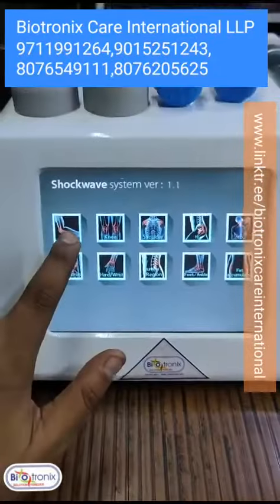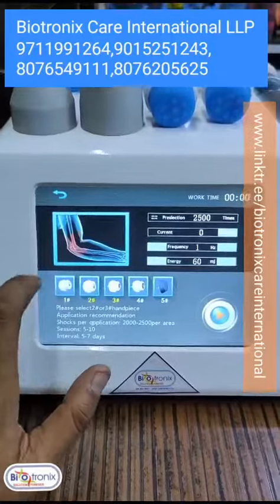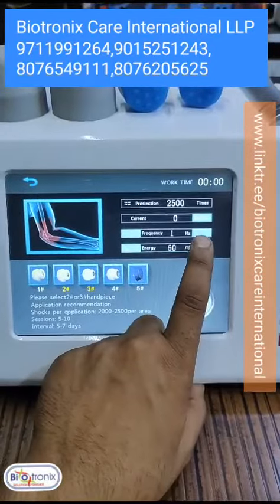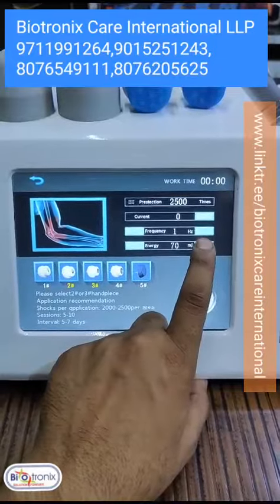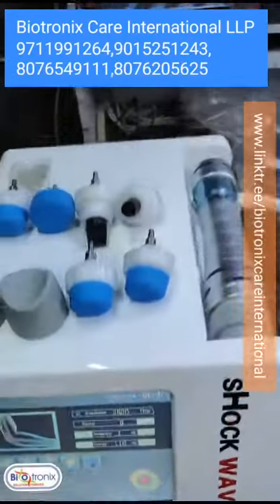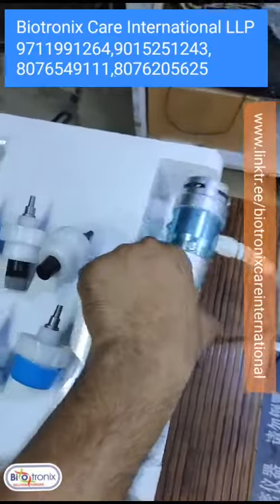When you press the start button — suppose you are selecting elbow — then you select the parameters and start. Until unless you press the start button, it will not start.